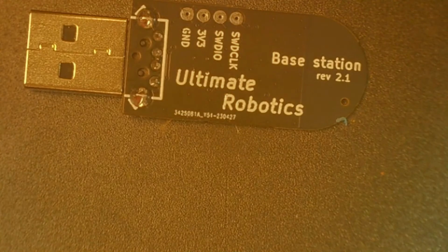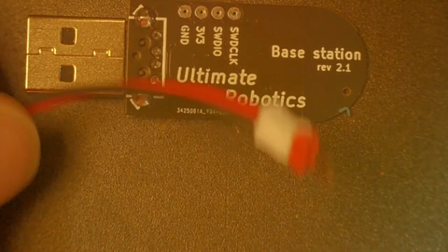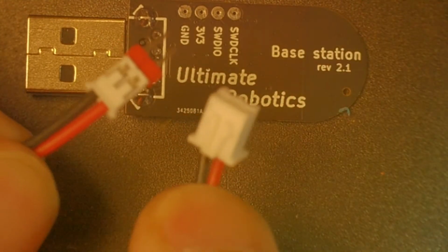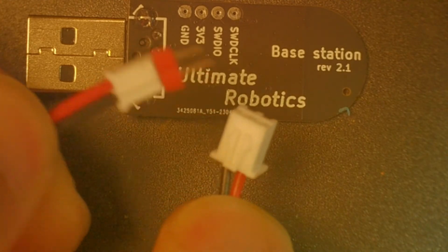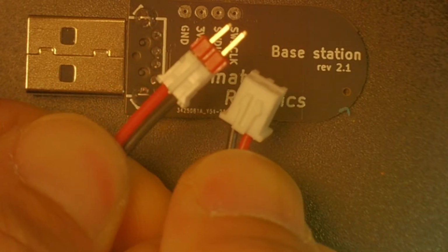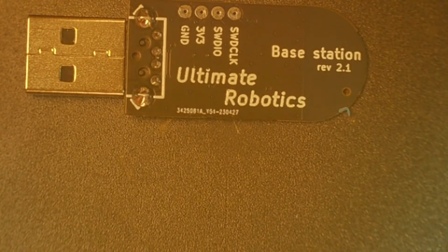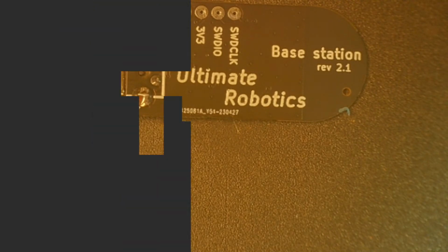I'm just gonna double check that my microscope is working, which it is. So we can go ahead and place that. You can see how the polarity of this is the opposite of this. Yeah, if they're lined up on the right side. But these are different size JST plugins anyway, so I've just been plugging them in like this. The uMyo for the time being. Okay. So I think I have everything. Perfect. So let's take a look here.